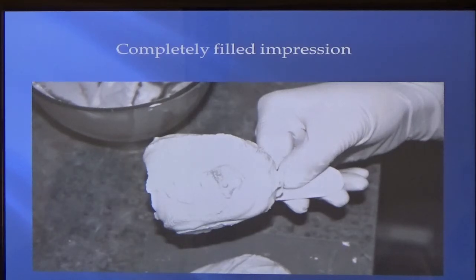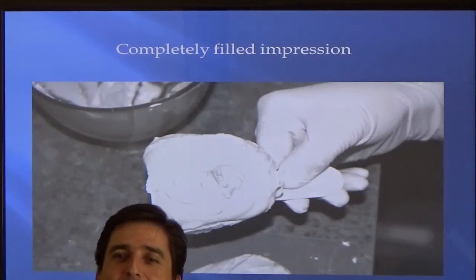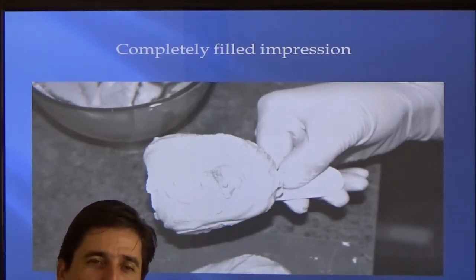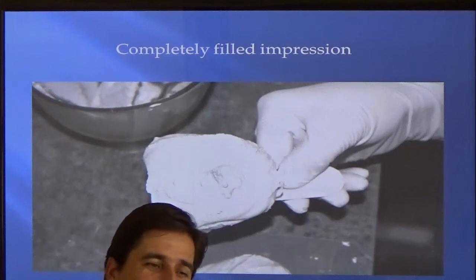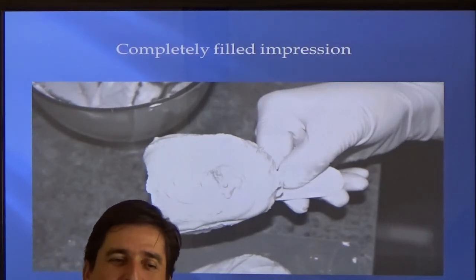No. Okay. I have a horrible gag reflex. I'm going to choke. I've never done these without totally dying and choking. Really? Horrible. Oh, yeah. So your partner, make sure you have a good mix. You don't want a watery mix. You're going to have lunch. Just because I love her teeth, they're so perfect. Look at them. Tiny little.